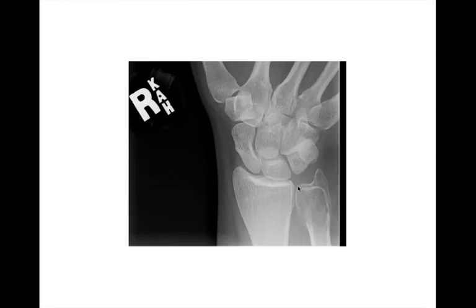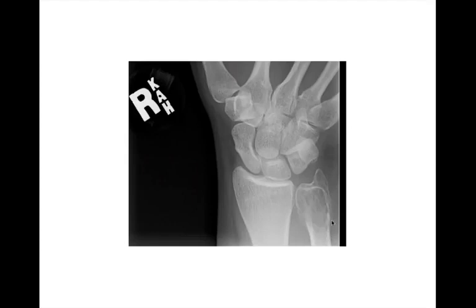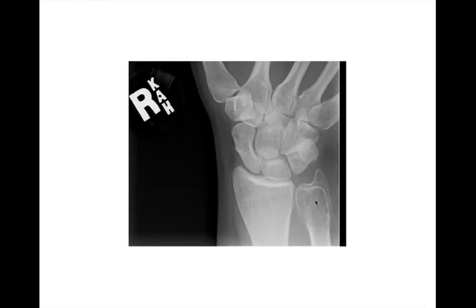Radiograph of the wrist: geographic lytic lesion, narrow zone of transition, non-sclerotic border, in the epiphysis and metaphysis, centrally located in the distal ulna. This was a giant cell tumor — extending all the way to the articular surface, which is a key feature. Also note the non-sclerotic rim, another key for giant cell tumor. Geographic lytic lesion, non-sclerotic border, epiphyseal-metaphyseal location. In this case it's just taking up the whole bone, so we'd say centrally located as it involves the whole of the distal ulna.